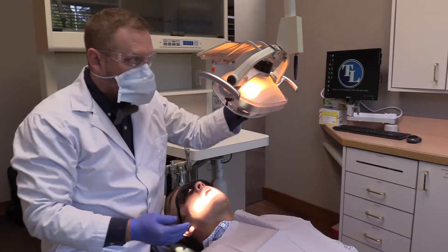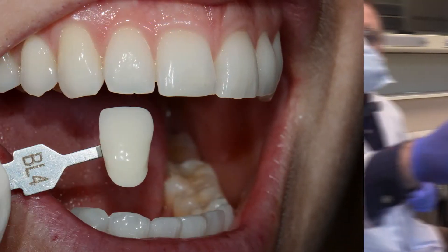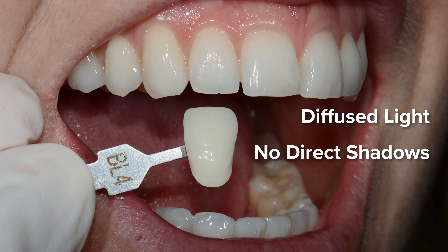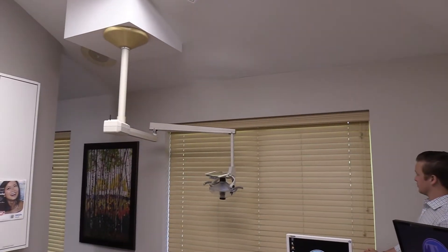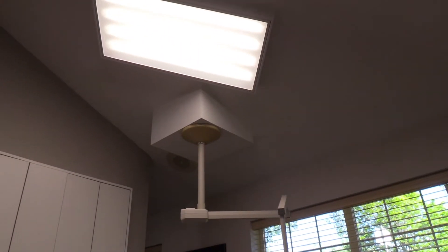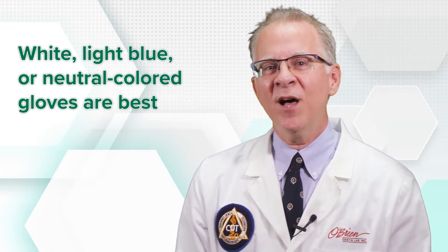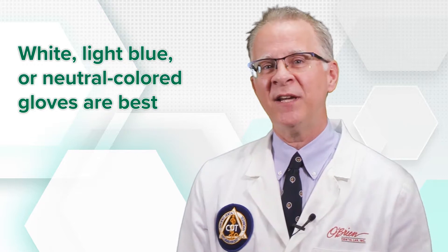Move the operatory light away from the patient — do not shine it in their face. Make sure the patient is in diffused light with no bright light or direct shadows. Be aware of colored or tinted office windows; use a shade to cover windows if necessary to block excess light on sunny days, and have enough corrected lighting to make up for cloudy days. A consistent setting helps remove some of the variables that frustrate accurate, repeatable shade matching.